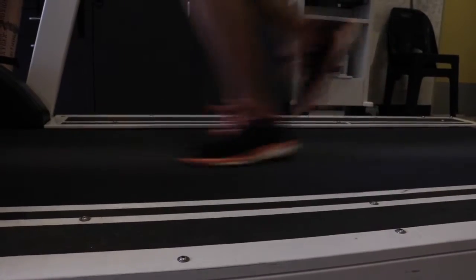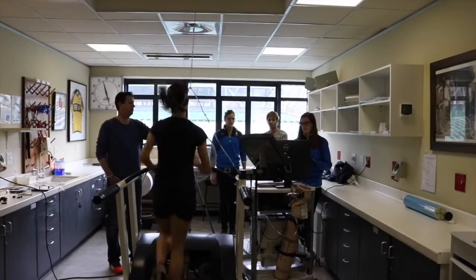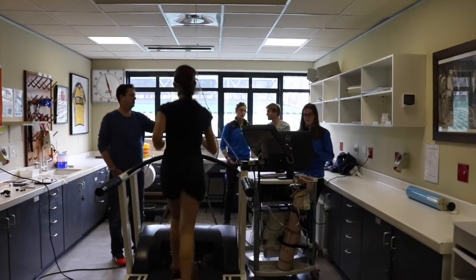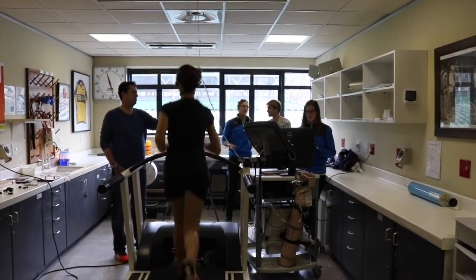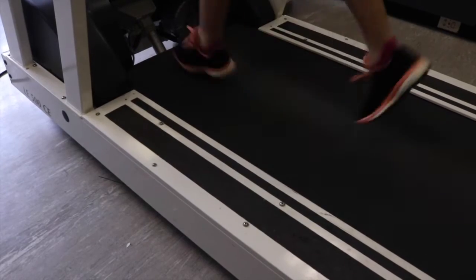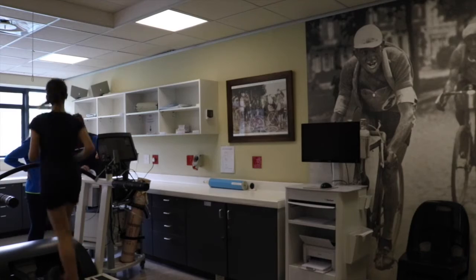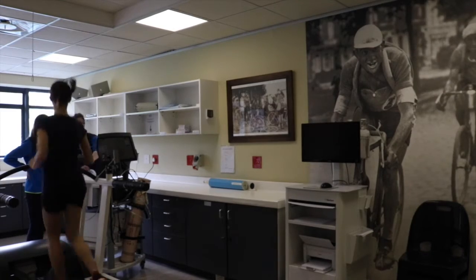You'll start at a certain pace and it will make you run faster, increasing the speed every minute until you can't face that speed anymore and you hop off the treadmill. For working out the zones, we look at two important points: the first is the crossover point where you go predominantly from fat burning to carb burning — that gives us zones 1 and 2. The next point is the lactate threshold, that moment where you feel you don't want to run anymore but rather walk — that gives us zones 4 and 5.